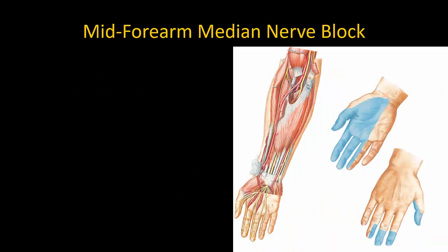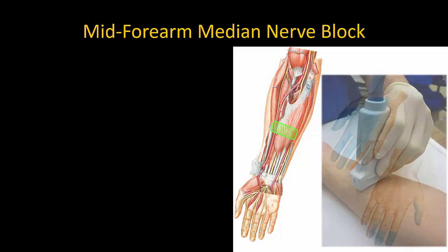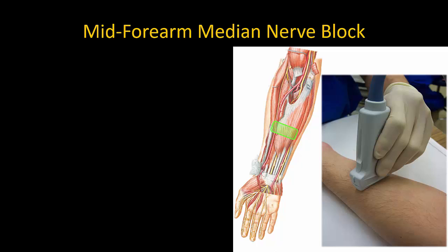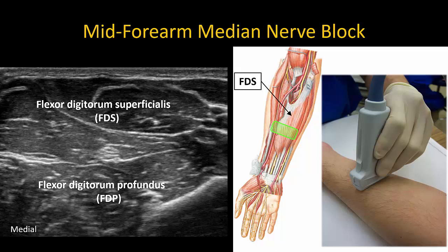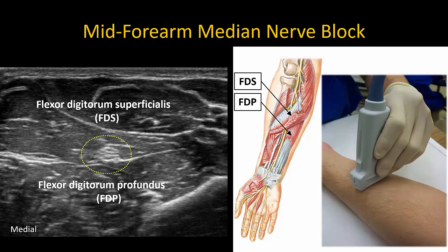Let's start with the mid forearm median nerve block. Position the patient's arm supinated at the elbow to expose the ventral surface of the forearm and place the probe in a transverse orientation on the fleshy ventral part of the mid forearm. At this location the median nerve is always sandwiched between the flexor digitorum superficialis and flexor digitorum profundus muscles. The nerve can be anisotropic, so tilt the probe back and forth as needed to light it up.